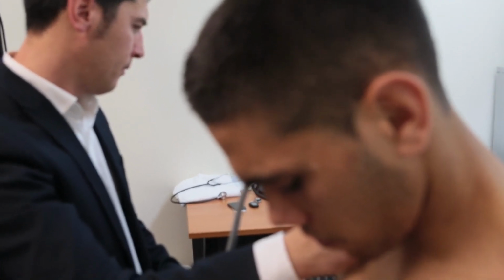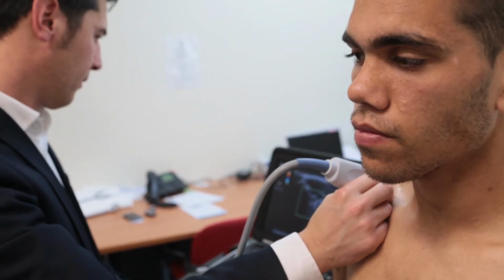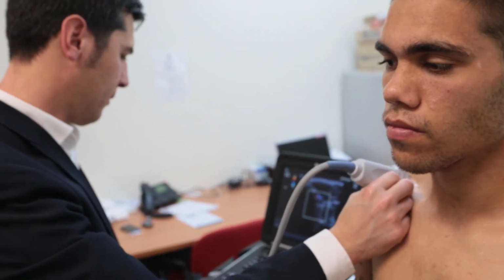And the main utility of having the ultrasound in that situation is that I can guide the needle into exactly the right place and reduce the risk of complications from injections. For example, around the chest wall and in the shoulder region where there are a number of vessels, or the lungs that we need to be careful of when we're performing injections.